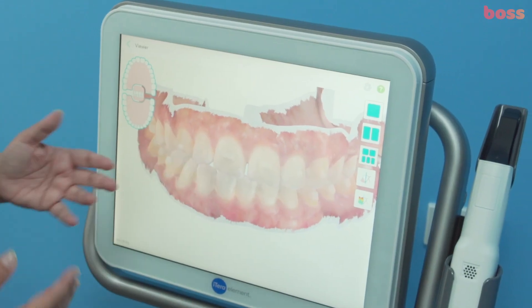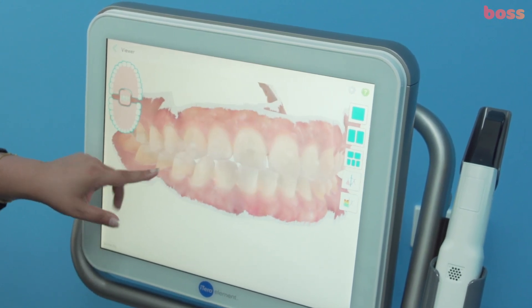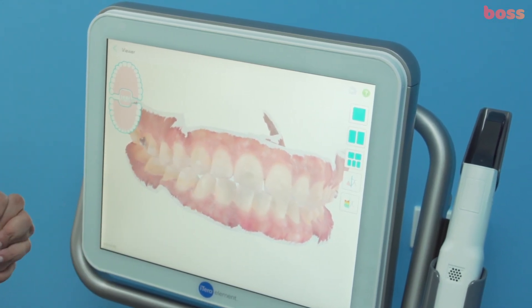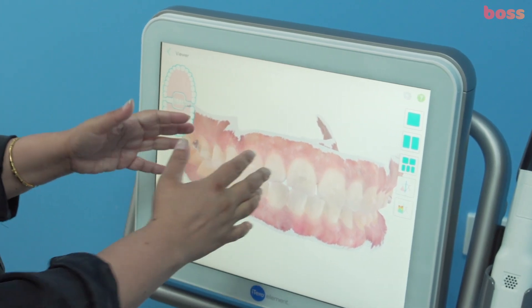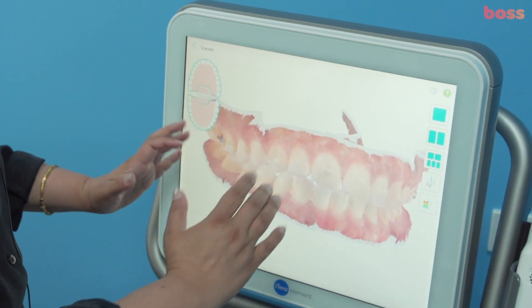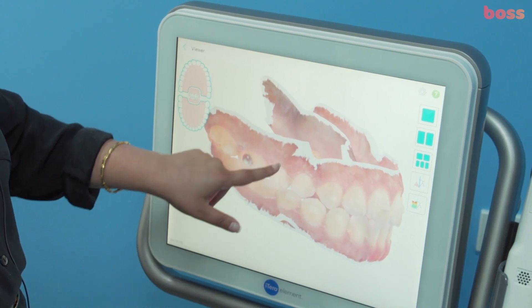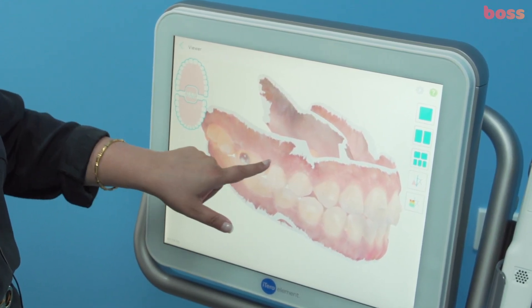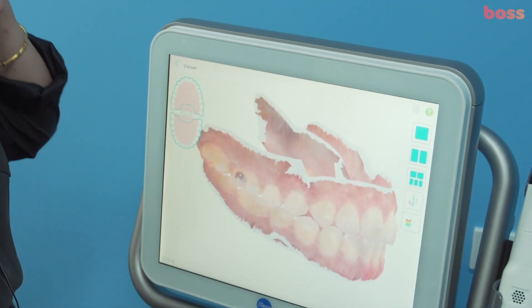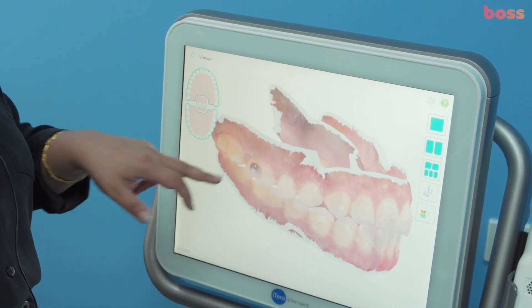Of course we're going to close the diastema in the next set of aligners, we'll continue extrusion, and we're pretty close to the finish line as the patient is quite happy with the aesthetics. I'll also ask my technician to expand the upper teeth a little bit more — the premolars are leaning in and we can upright the lowers by about a millimeter. One thing to notice: tooth 15 is extruded and 14 hasn't, so we need to level those gingival heights — 15 has to intrude slightly.